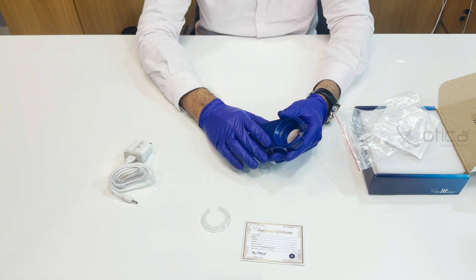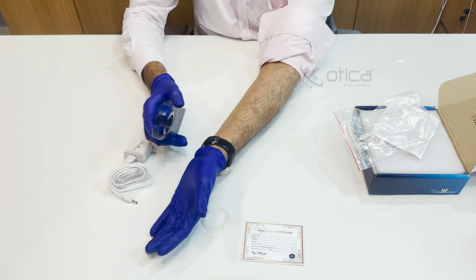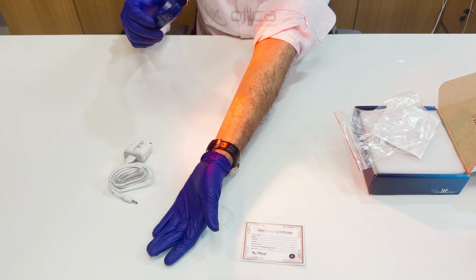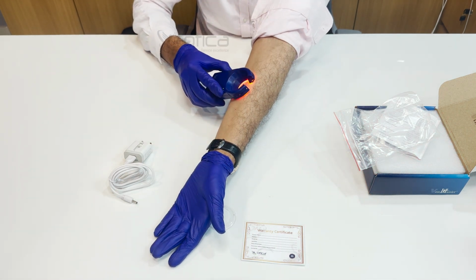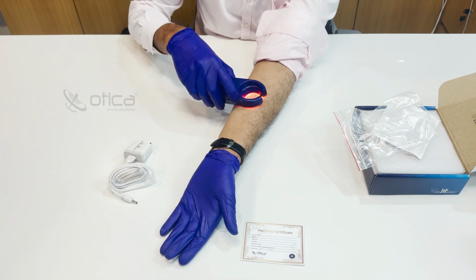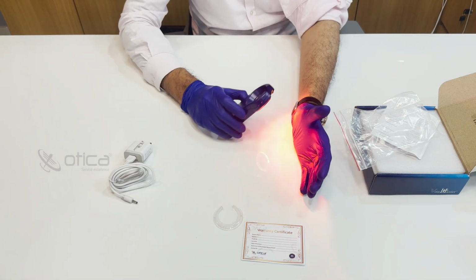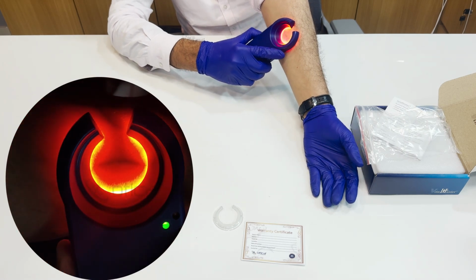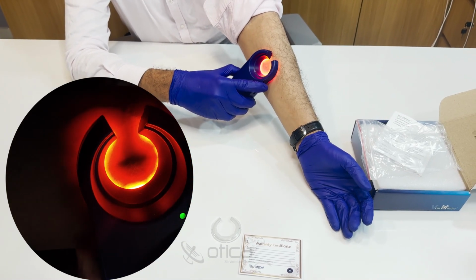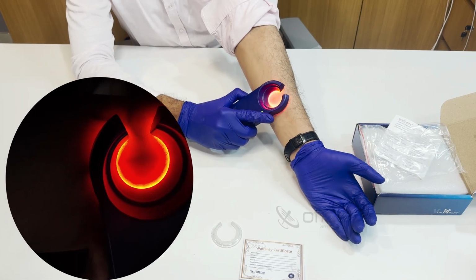We assure you this device gives you a proper view of the vein. You have to look for the vein in the patient's arm, where you have to touch the device on the body. This is not a device where you can just shine the lights. You have to touch the device, which is very important. If you make a loose connection with the skin, you will not be able to see the vein. When you are in a very bright room, you have to reduce the room light to get optimal results. At the clinic, low light is recommended. Otherwise you can see the vein with bright light also.